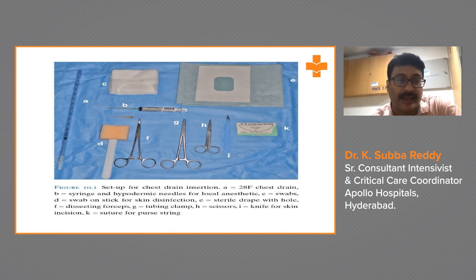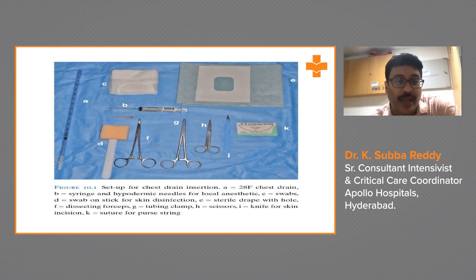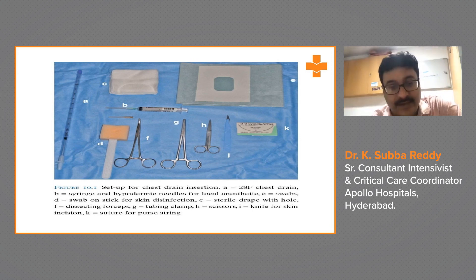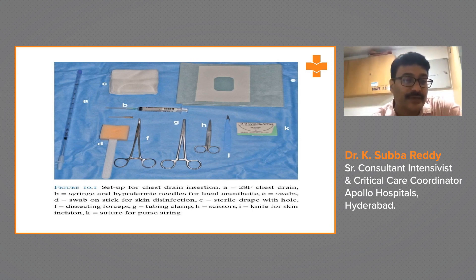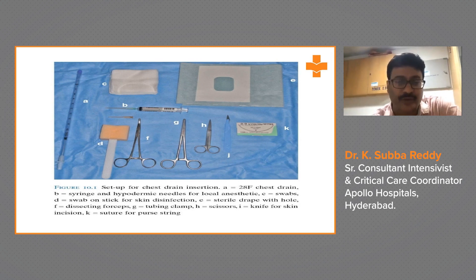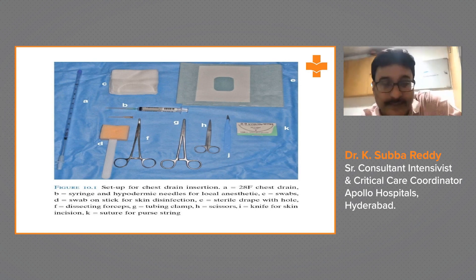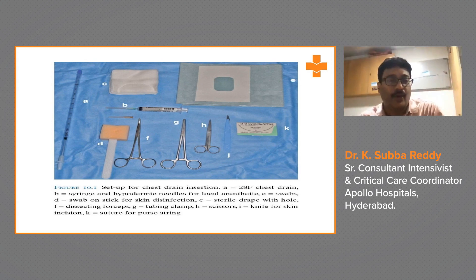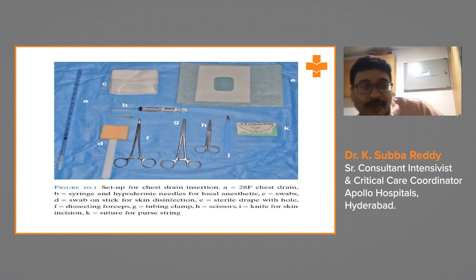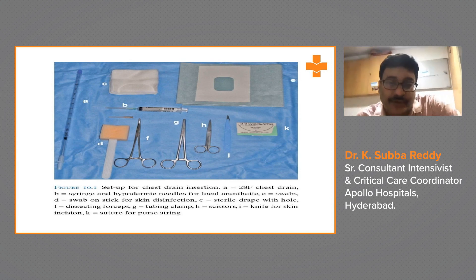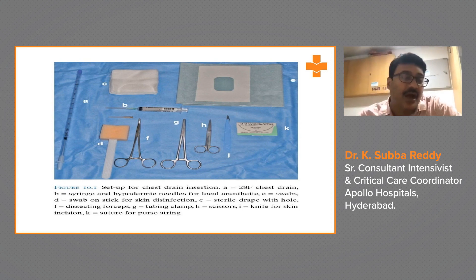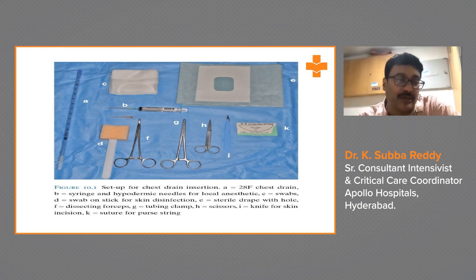Equipment needed includes a 28 French chest drain, a syringe, hypodermic needles for local anesthetic, swabs or gauze with chlorhexidine for skin disinfection, a sterile drape with a hole, dissecting forceps, tubing clamps, scissors, a knife for the skin incision, and sutures for closure.